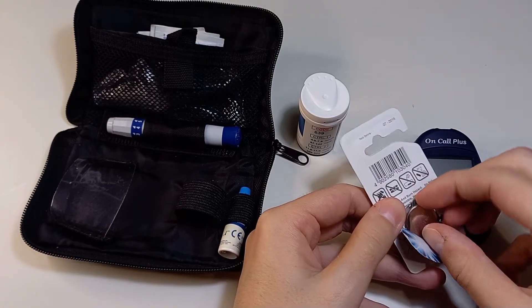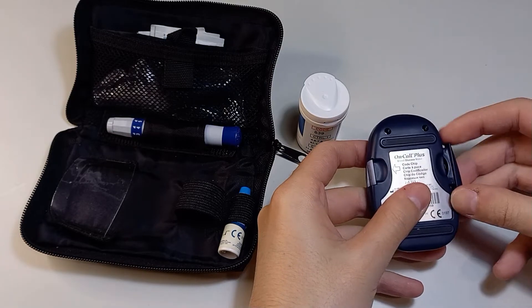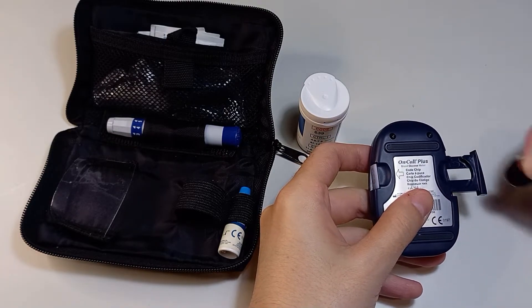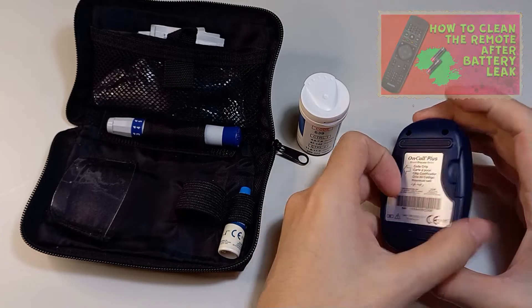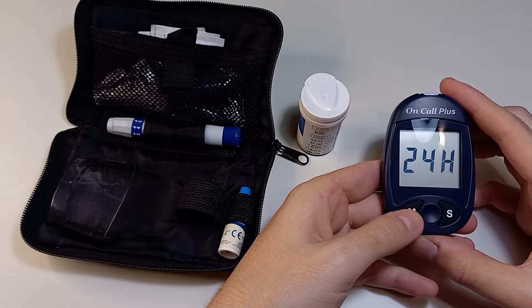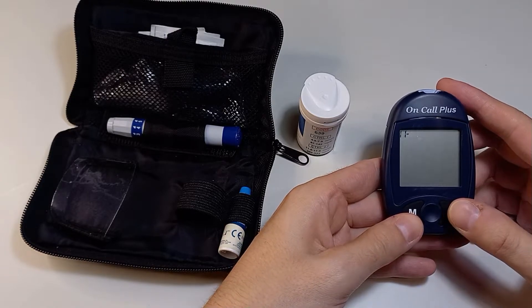I don't use the monitor often so I keep the battery in its package. If you leave the battery inside without using the monitor for a long time it can leak and damage the device. When you insert the battery you can set the date and time — I will skip this part because I will remove the battery after checking my blood sugar level.